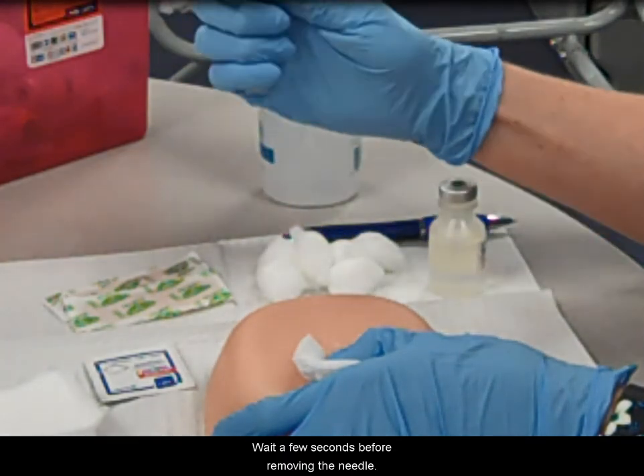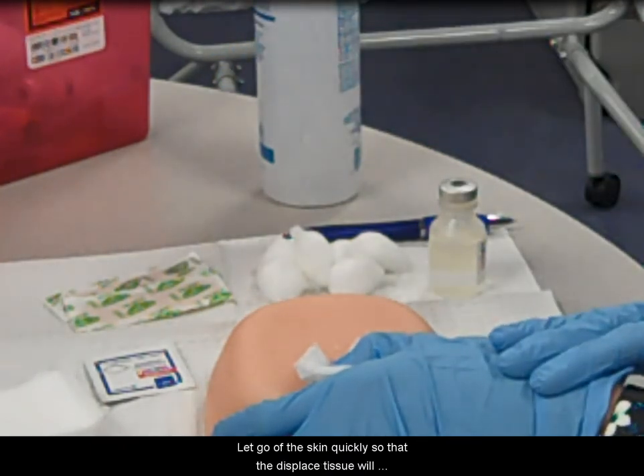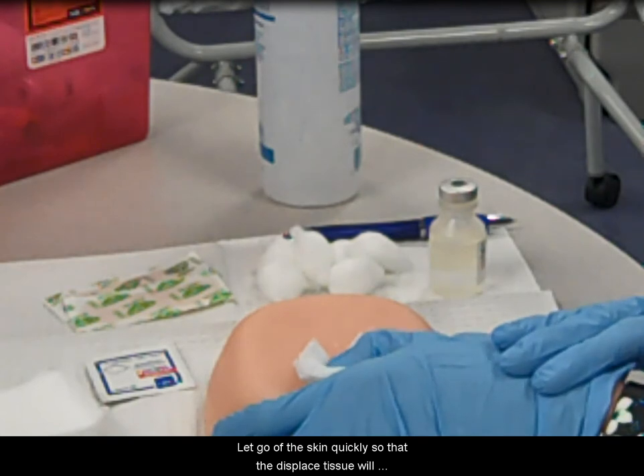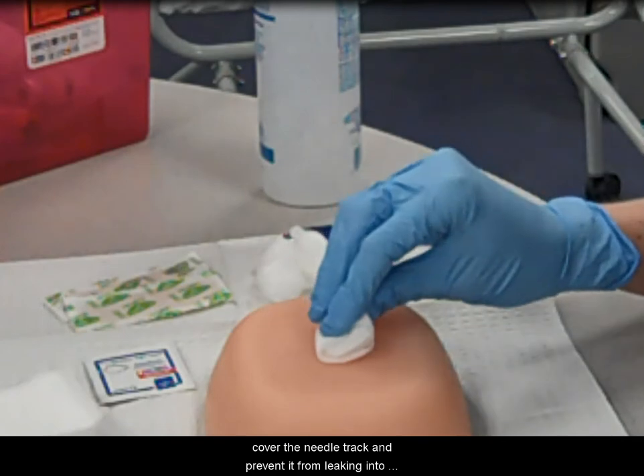Wait a few seconds before removing the needle. Remove the needle quickly, apply the safety cap, and discard. Let go of the skin quickly so that the displaced tissue will cover the needle track and prevent medication from leaking into the surrounding tissues.